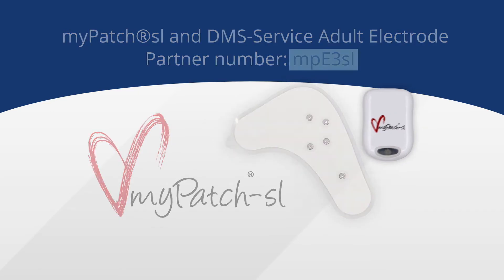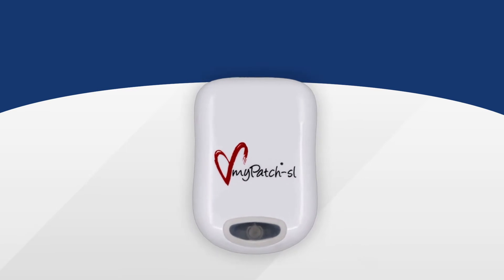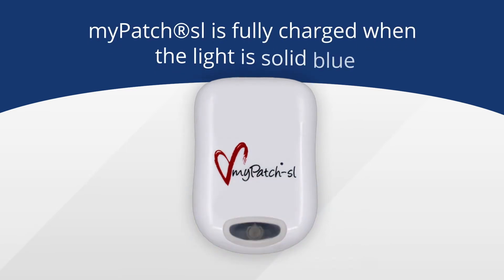Prior to hooking up the patient, you want to make sure you have a fully charged MyPatch SL recorder. Make sure the blue light on the recorder has gone from flashing blue to solid blue in the charging station.